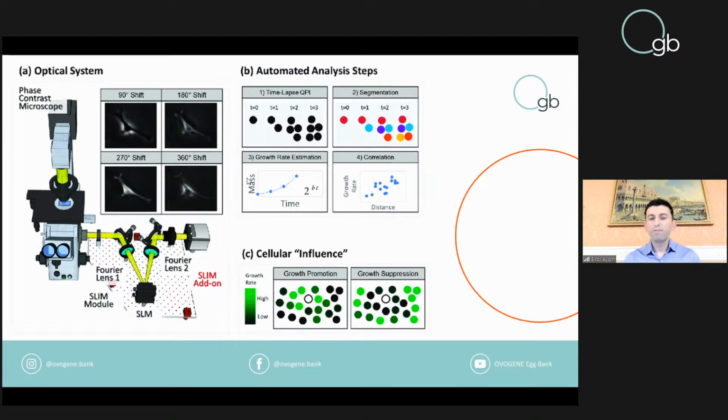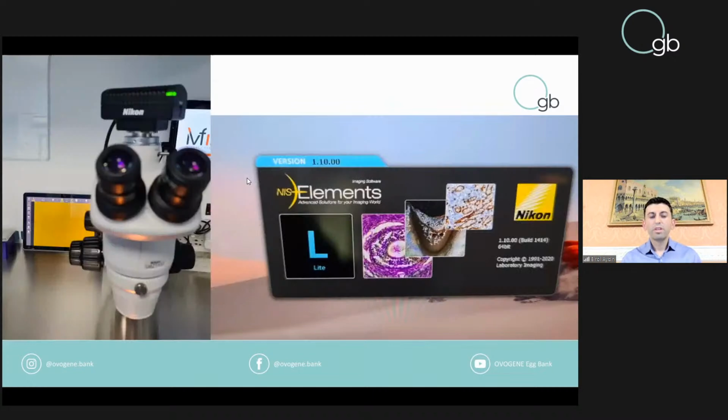So all information is coming from different sources. It doesn't matter how many embryologists are working in how many workplaces, because each of them has this dynamic camera and all information is collected in the main computer. So this is how it looks in the laminar flow cabinet.